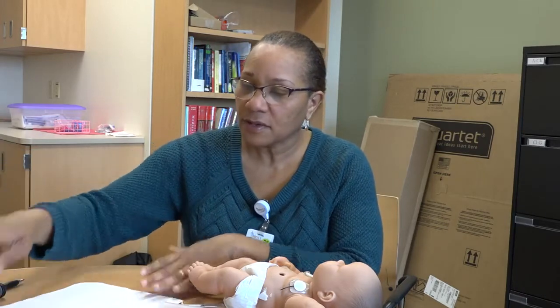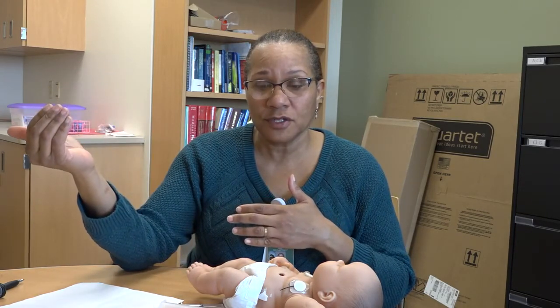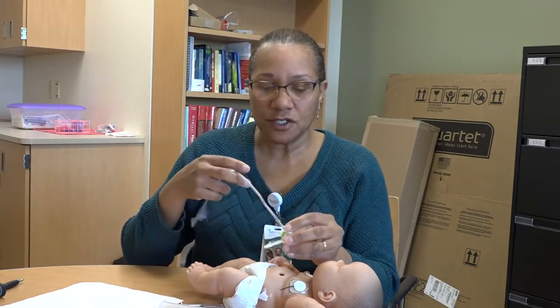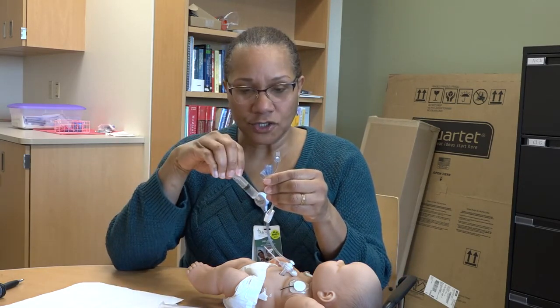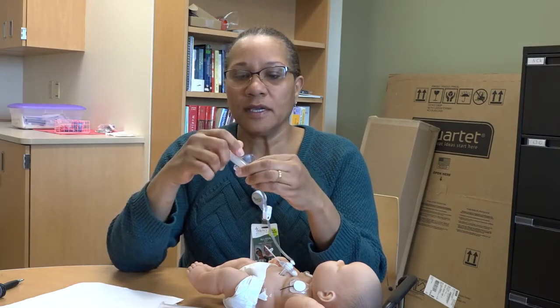The last thing for us to talk about is administering medications. Most medications are liquid anymore, so there's no problem with administering them. You want to be sure that you do not mix your medication that you're administering with your feeding. You want to give the medications one at a time through the medication port. So once you have your feeding extension tubing attached, if you're done with your regular feeding, then you're going to want to do a water flush, and then you can open up your medication port and administer your medication.